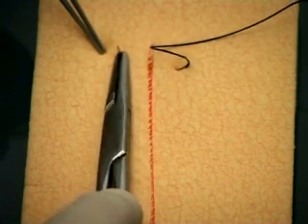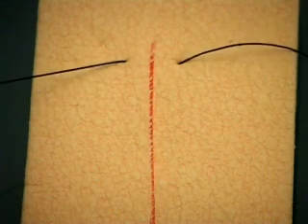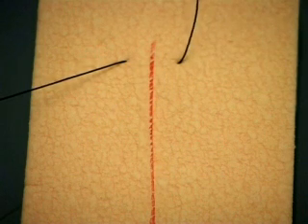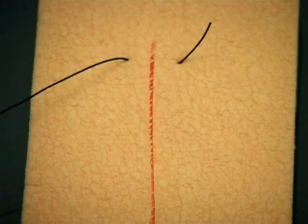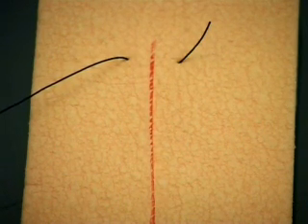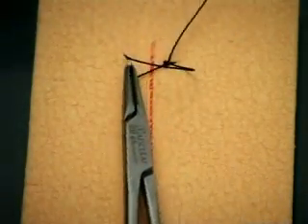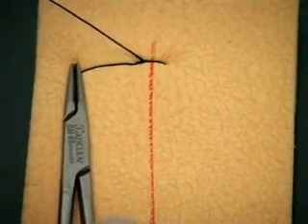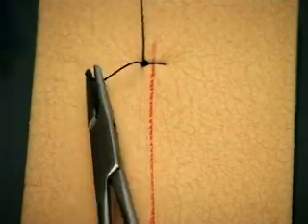If the wound edges are close together, you can drive the needle across both sides of the wound. Otherwise, you may find it more accurate to re-grasp your needle before placing the suture on the other side of the wound. Pull on the suture, leaving a convenient length at the tail end — this will depend on whether you intend to use a hand tie or an instrument tie. Tie a knot to one side of the wound, rather than placing the knot directly over it. Take care to just approximate the wound edges and not strangle the tissues.